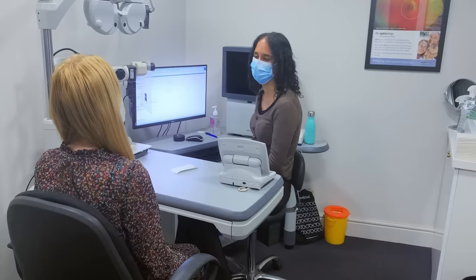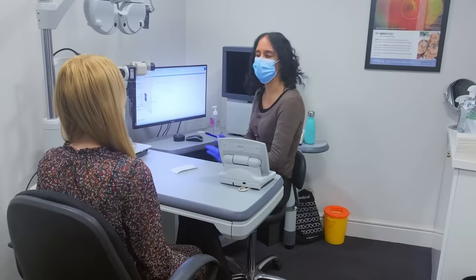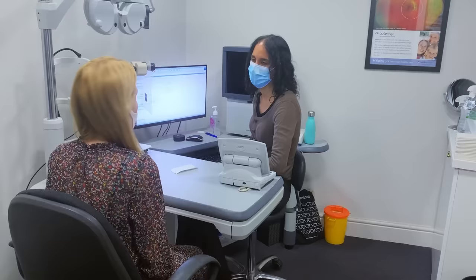Good, good, good. And when you're reading small print close up in a book or on the screen, presumably you don't wear your glasses. Yeah, no, I don't wear my glasses for close up. Fine. And any problems with your vision for that? No, not for that, no. Okay, good.